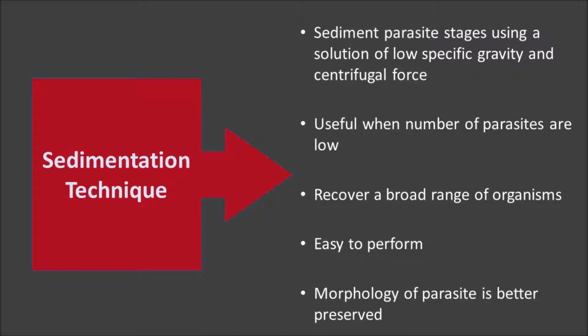In order to obtain the sediment quickly, we can centrifuge the preparation. Or, if you don't have a centrifuge, you can also leave it overnight for the parasites to concentrate at the bottom slowly. Solutions used for this procedure are usually formalin ether or ethyl acetate. Here we will show you how to do the procedure using ethyl acetate rather than using ether, which is flammable and could be dangerous.